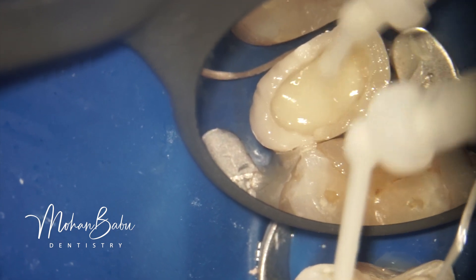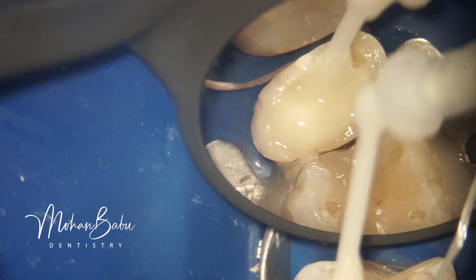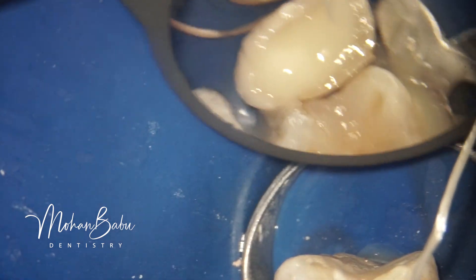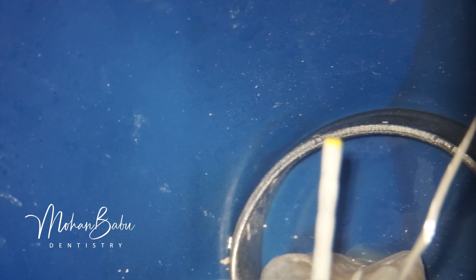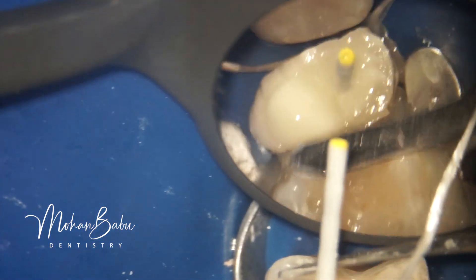I am injecting a dual-cure core material into the post space and core space together. After that I am placing the fiber post — pre-checked and verified for fit — into position, checking its placement carefully, and then light curing it. After light curing, the excess fiber post has been cut off. With this, we have finished the root canal treatment and post and core with proper isolation.